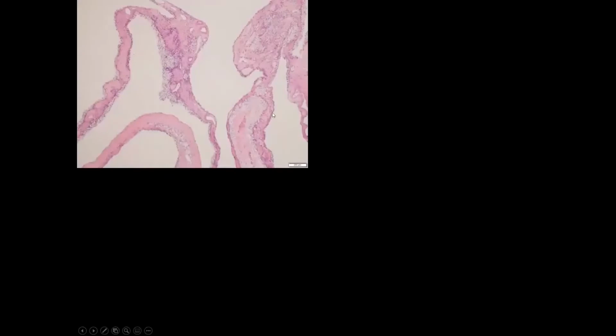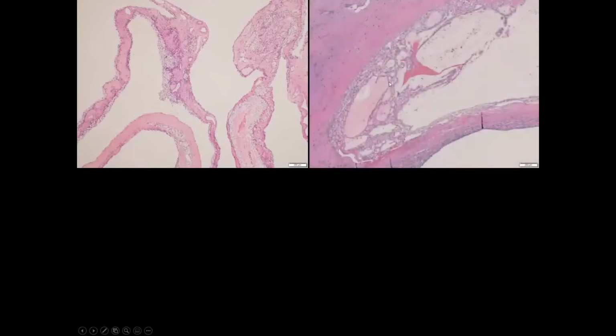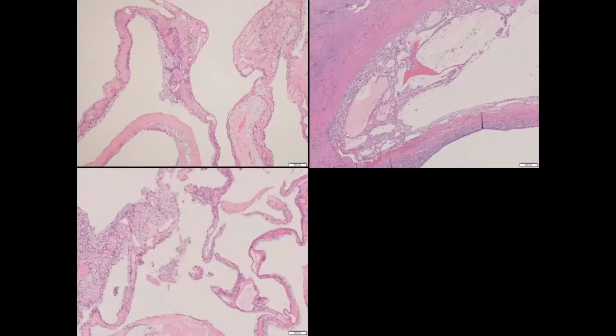So this case, for example, is again multiloculated cystic, but notice a difference in the lining cells. In some areas, you may see a single cell layered lining, but here clearly this is stratified and multiple cells are lining this. So this is way too complex for you to call it a low malignant potential neoplasm. And then here's another case where again it's multiloculated cystic, but clearly there is a lot of complexity in the cells lining. In fact, they are starting to form some nested growth pattern inside the lining itself. So both these cannot be called multiloculated cystic renal cell neoplasm of low malignant potential.